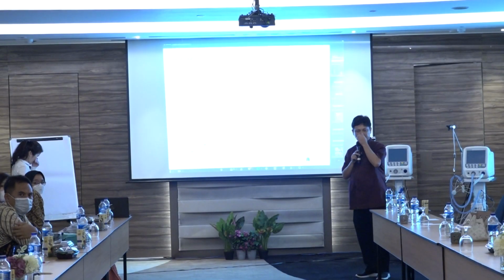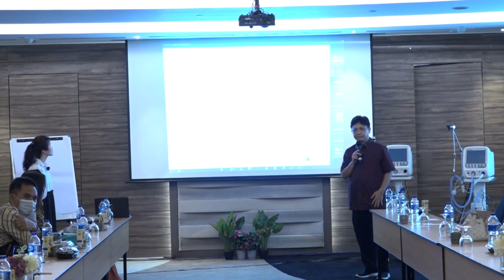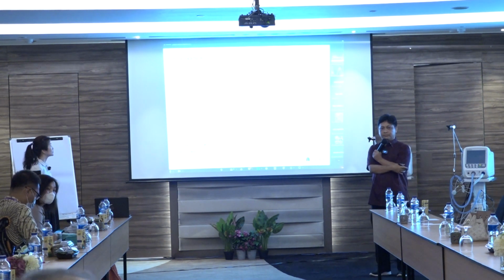Itu bagaimana kita tahu, karena kalau hasil dari Dr. Adi nggak adanya kan tentang kematian, mortalitas, tentang BPD ya dok. Tapi nggak ada tentang pneumotorak nih. Dari penelitian Dr. Adi itu pada saat kita naikin PEEP-nya sampai kita tahu bahwa dia tidak akan mengalami desaturasi lagi, lalu kita turunkan, ada nggak yang sampai di atas 9 itu, walaupun di jurnal bisa ada yang sampai 10 dok, yang terusnya jadi pneumotorak? Lalu apabila jadi pneumotorak itu diapain? Apa di-exclude? Apa langsung ada tindakan apa? Pertama mungkin pertanyaan untuk Dr. Adi tadi. Ya, untuk yang kedua tentang FOT ini.